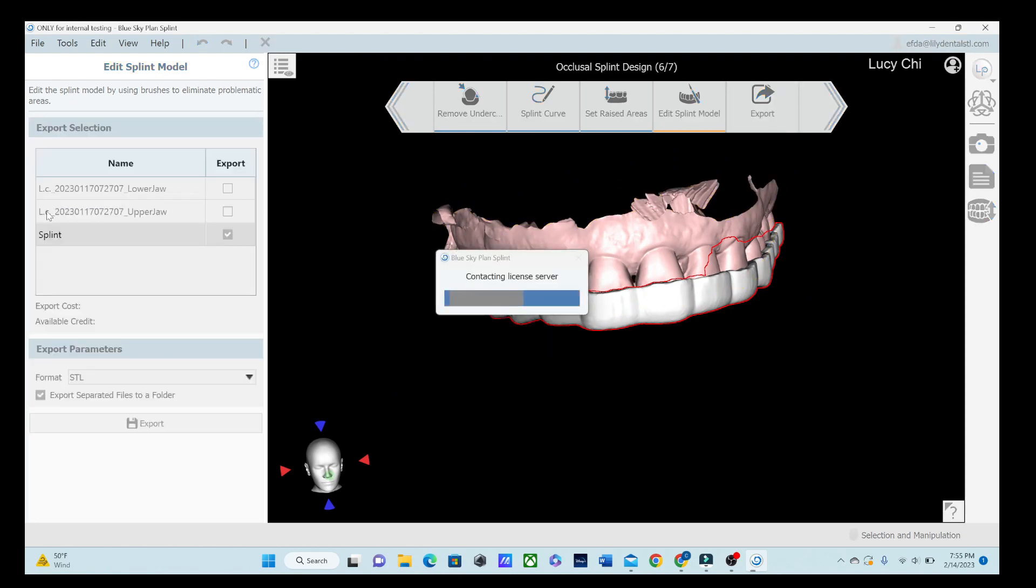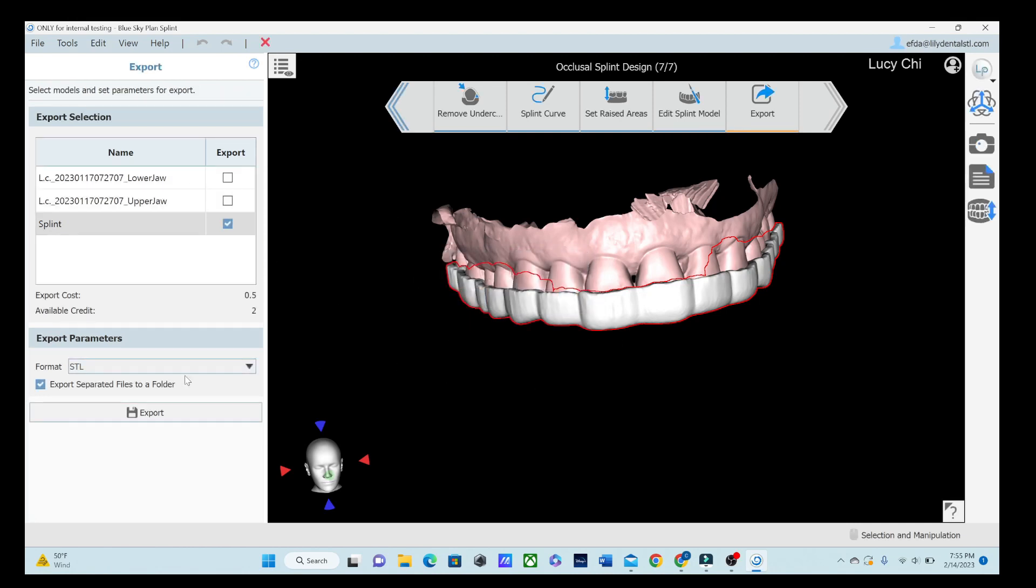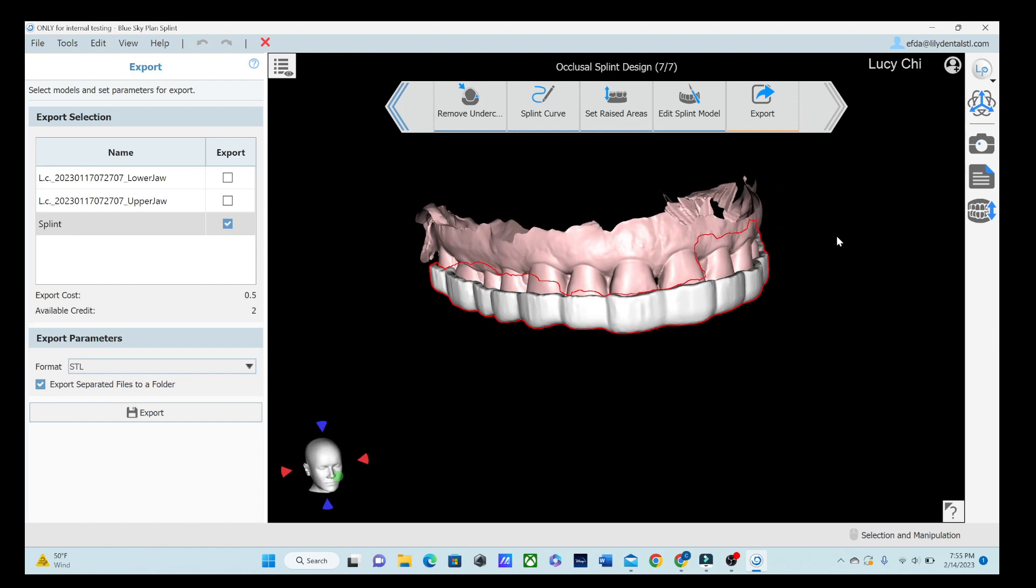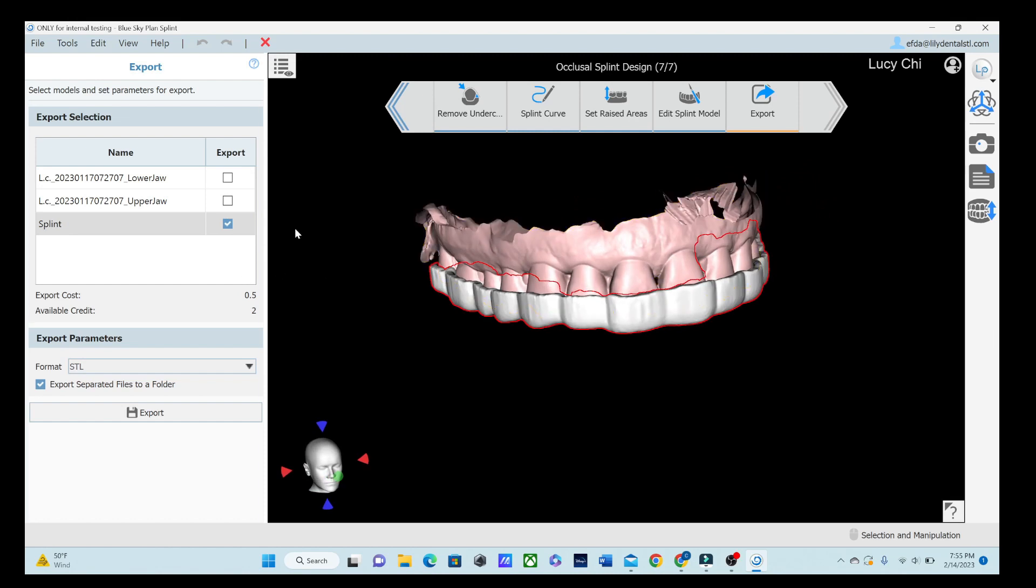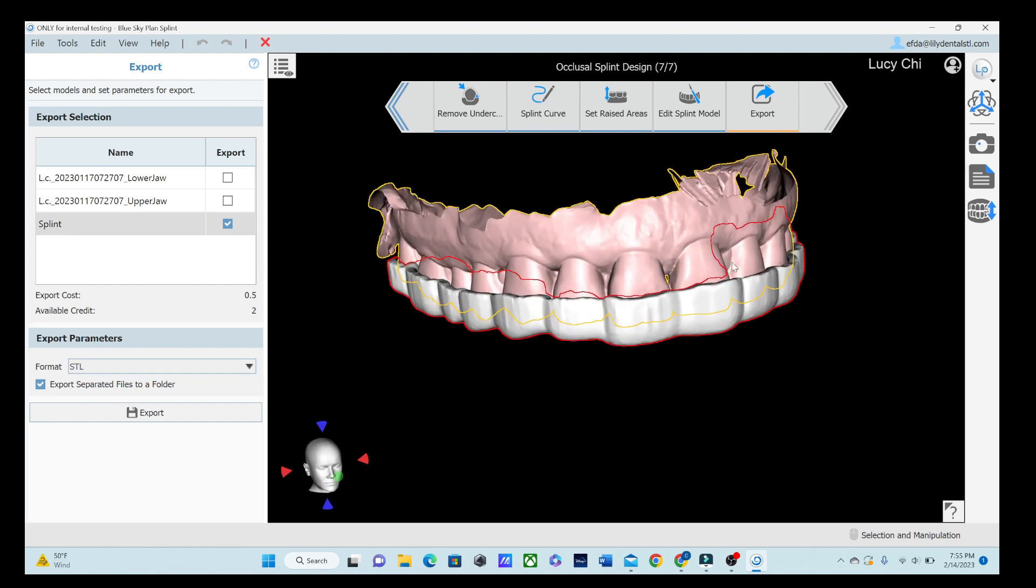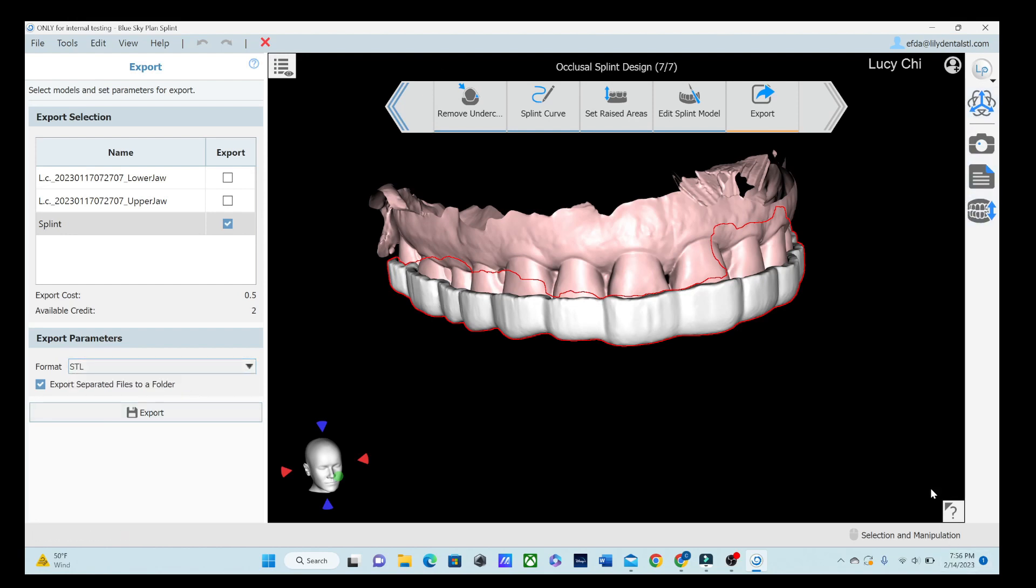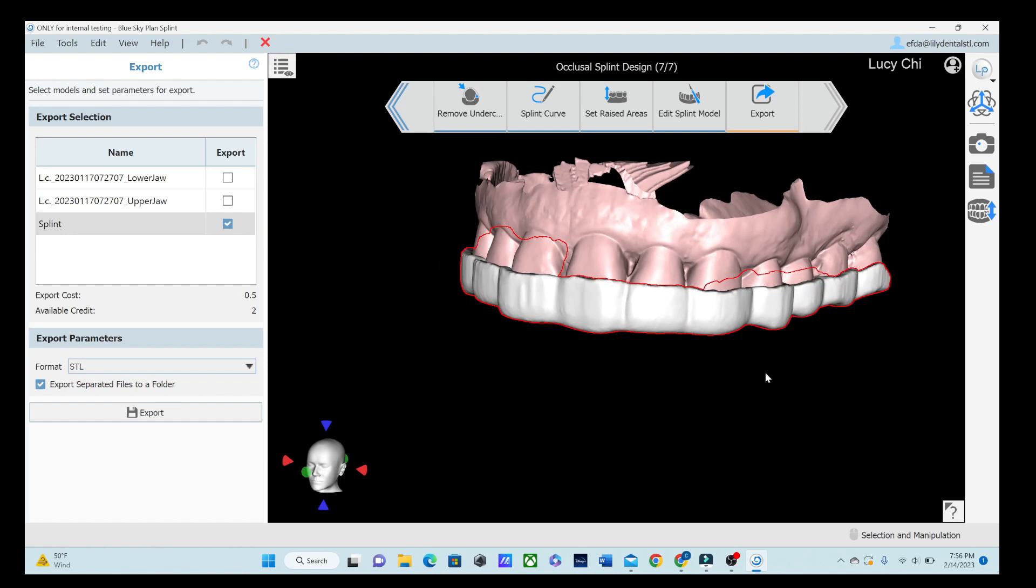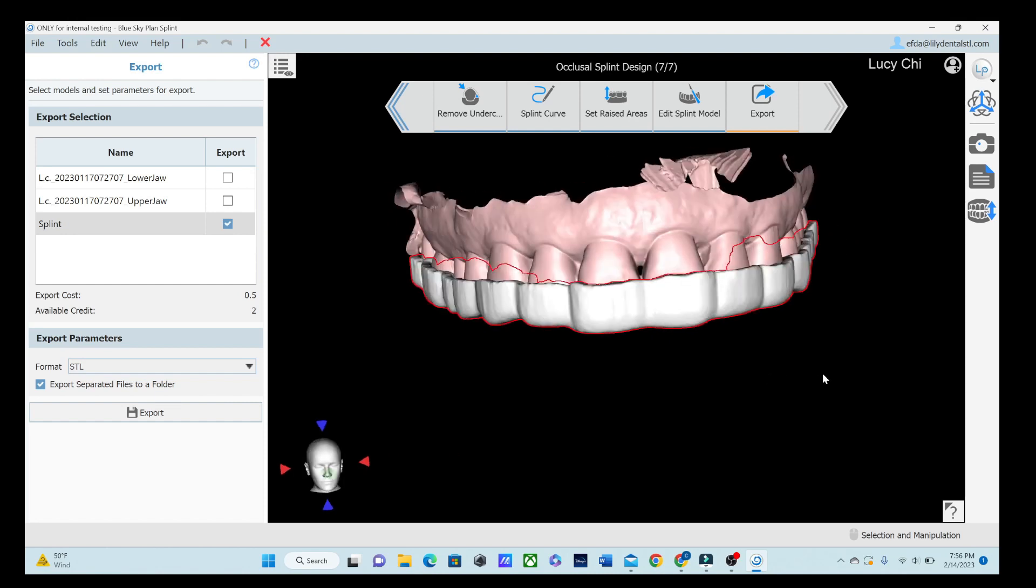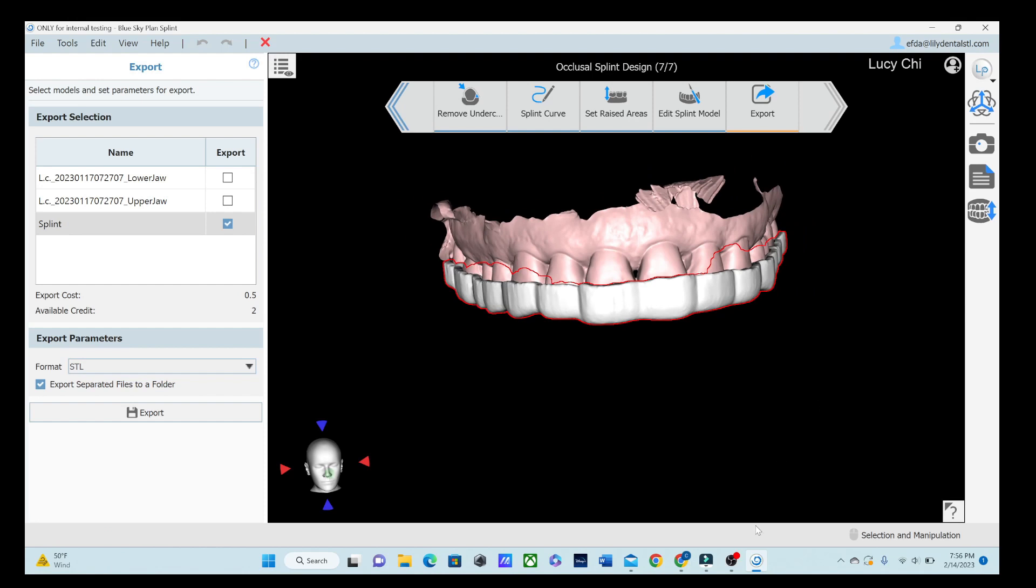Then all we have to do last thing is go to export. It's going to contact the license server like it always does. It only costs half an export which is nice. You can export the upper and the lower jaw if you did some manipulation to them but I didn't do any manipulation so there's no need to export that. Do it as an STL or an object and export that easy. I think this is a great program for assistance. There are some limitations to it but I'm sure that they will just continually improve it. We do use BlueSky Bio for a lot of other things so we were excited to see it. Stay tuned.